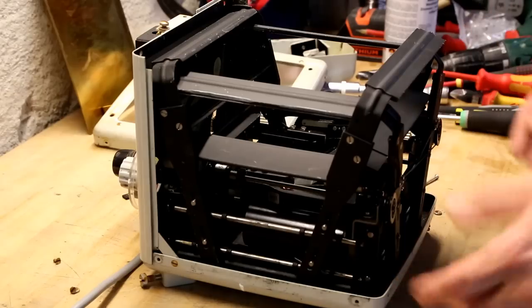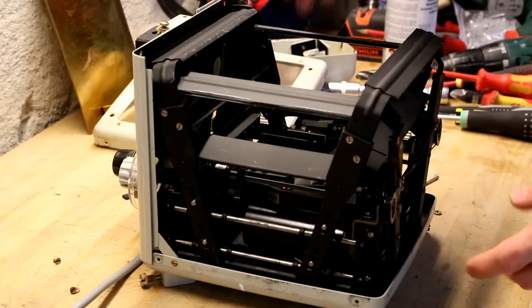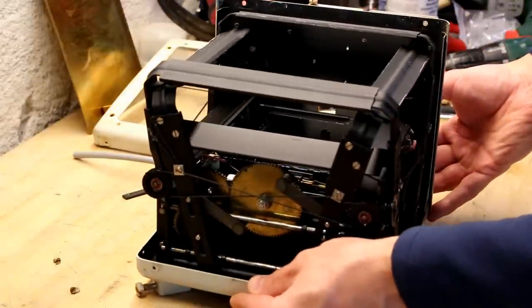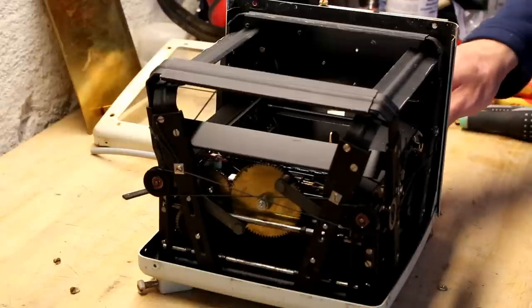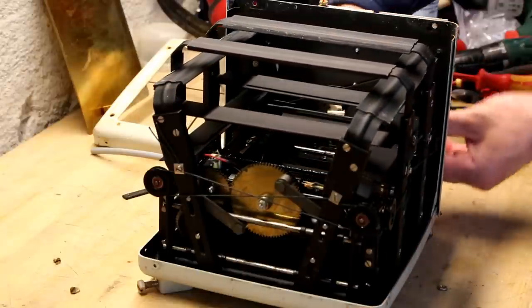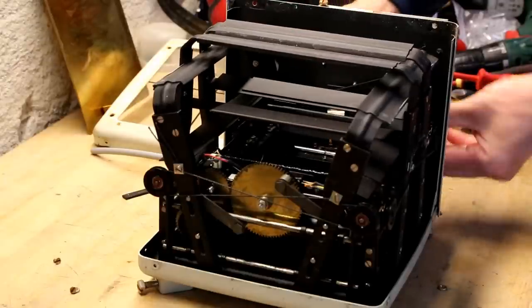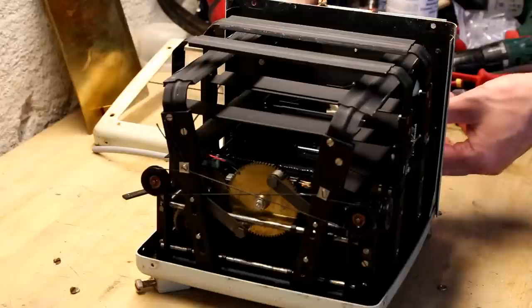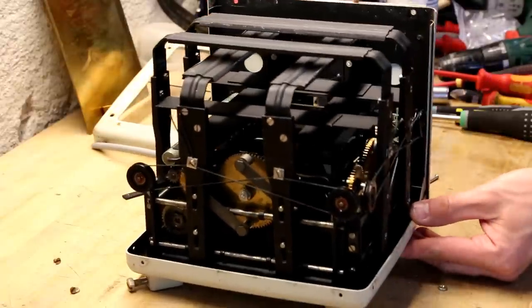Now this is a lovely piece of mechanics. Just look at all these blinds, the mirrors, the nice brass gears that you can see here in the side view. I just try to turn it. You can see it is actually a double blind. It also has these small wings down here that turn along with it. And there's the other double blind here. Okay, so that actually moves something.